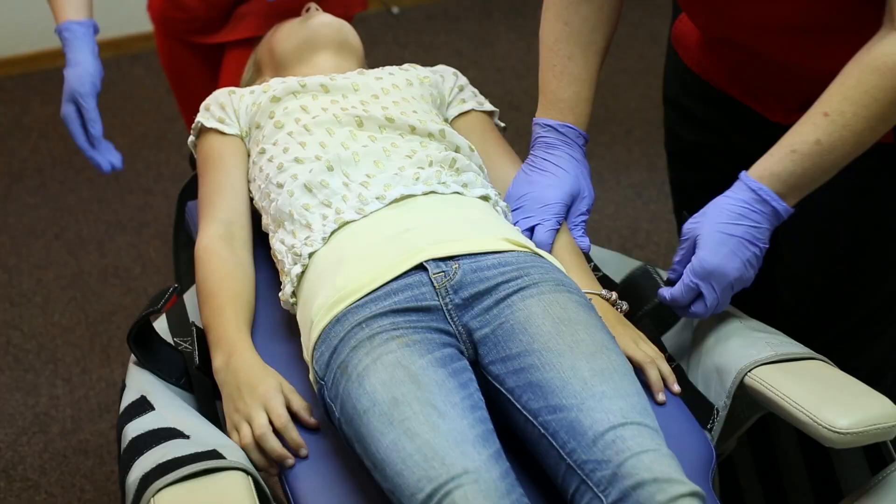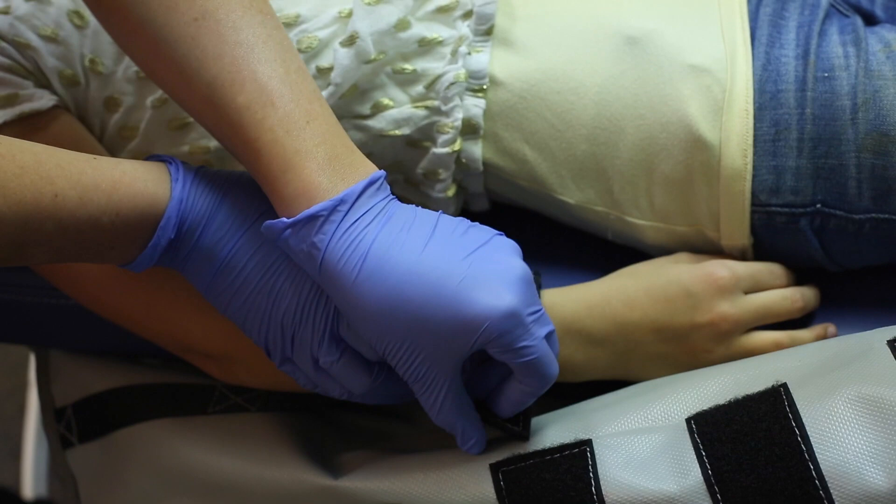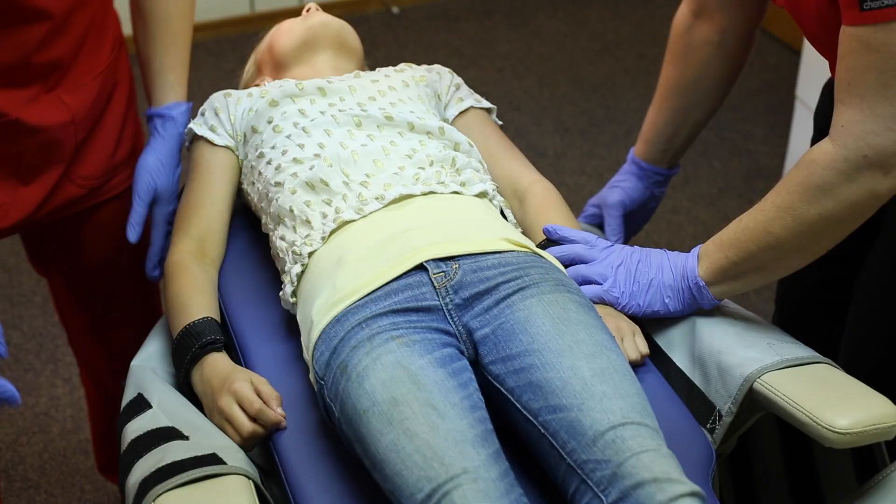Position the patient on the Joey board with the patient's head in the center of the head cushion. Secure the wrist straps.